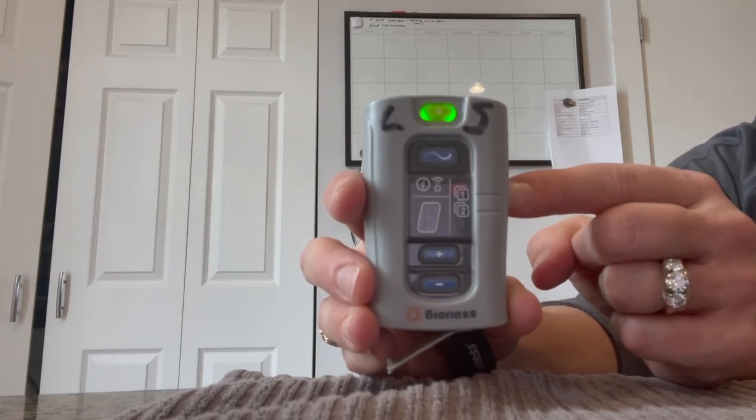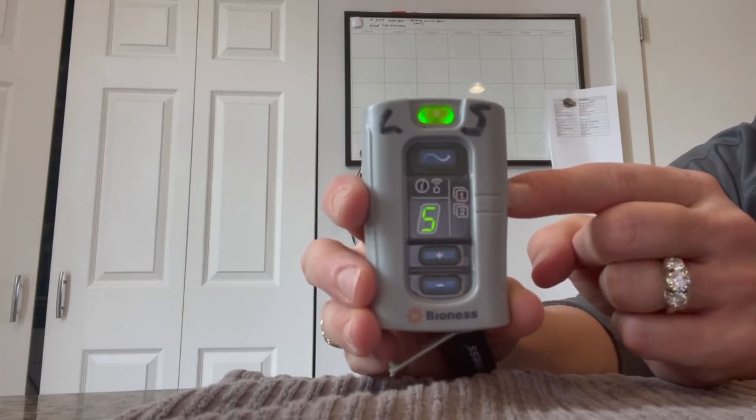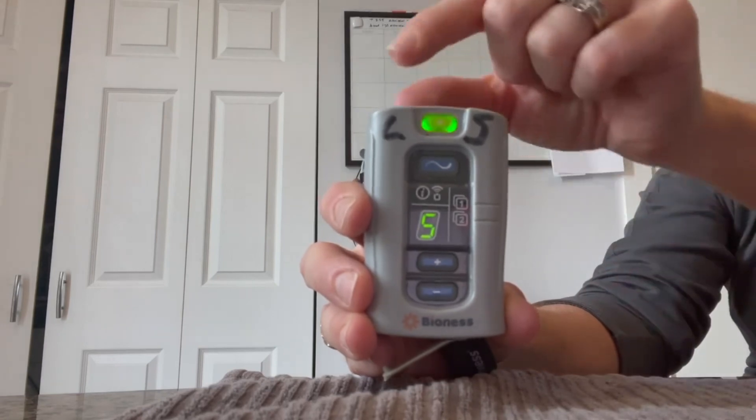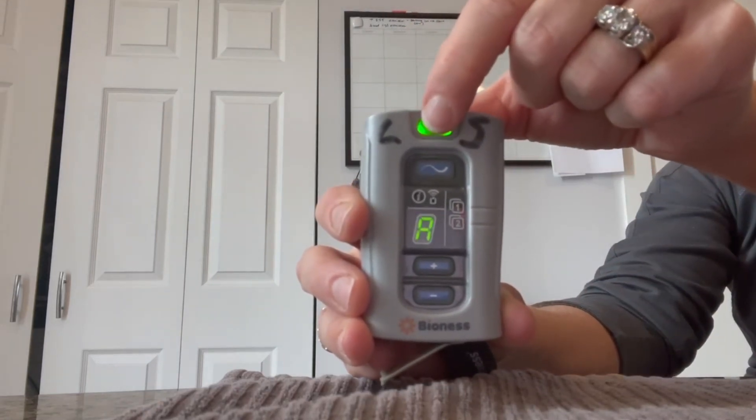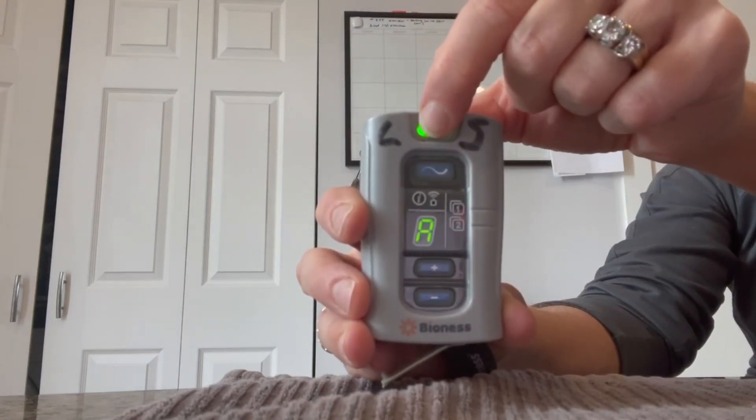When I'm completed with my treatment session, I want to power the control unit off using the power button at the top.